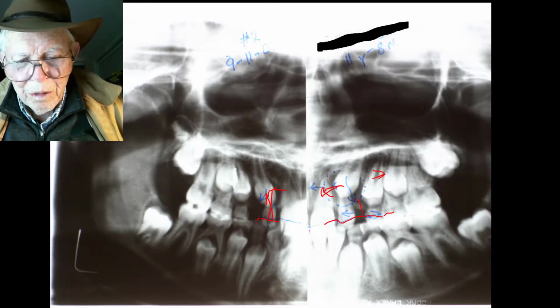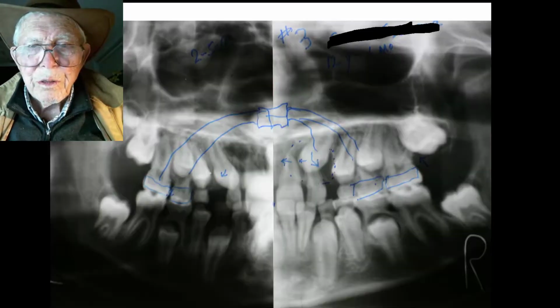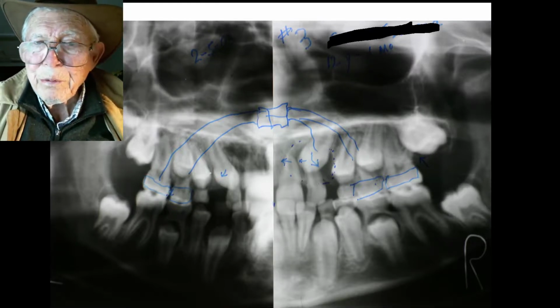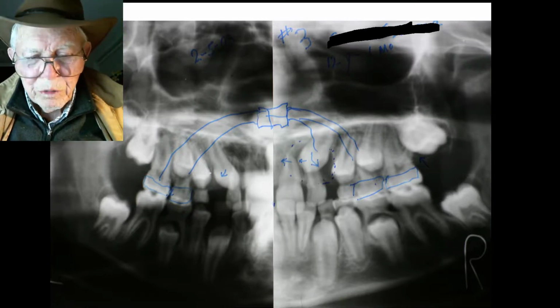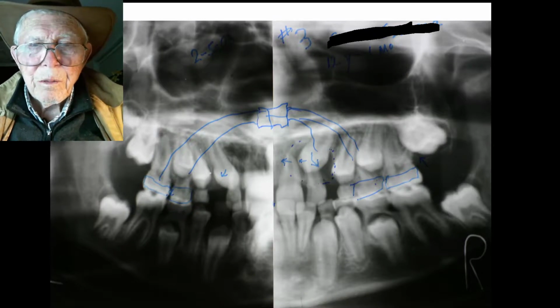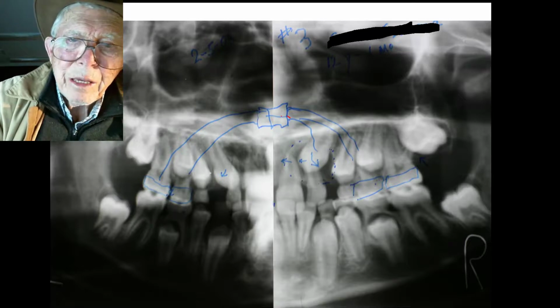We need to add some more space in there. So there it is like that. When they came in at this time, we realized we had to put a palatal separator. We were not getting where we wanted to go. So we put a palatal separator in, and the force in the palatal separator is back in the back. It's not too much up here in the front.